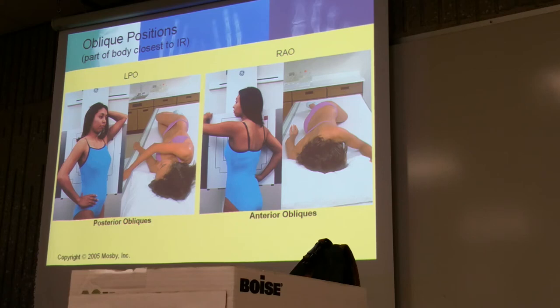Now I'm a little bit confused. Right. So if you say right lateral recumbent position, lateral projection, now I know what you're talking about. I can even say lateral projection, right lateral recumbent position. See, I just switched the order, but I'm describing what it is that I'm talking about. Both are okay, as long as I can distinguish the projection from the position.